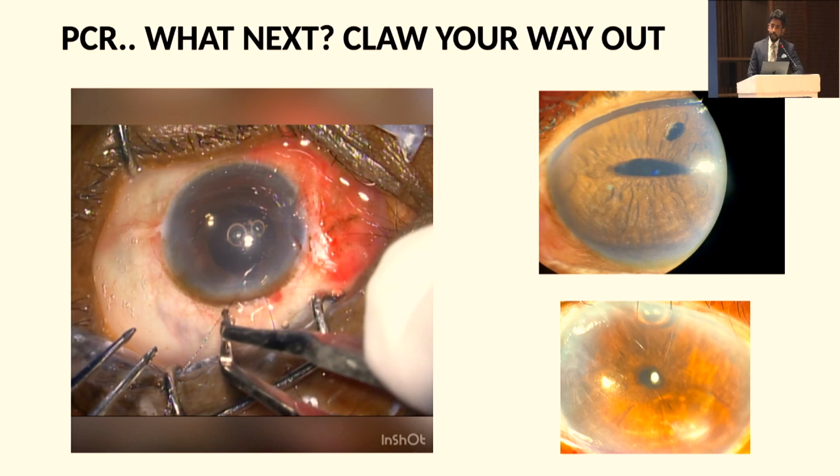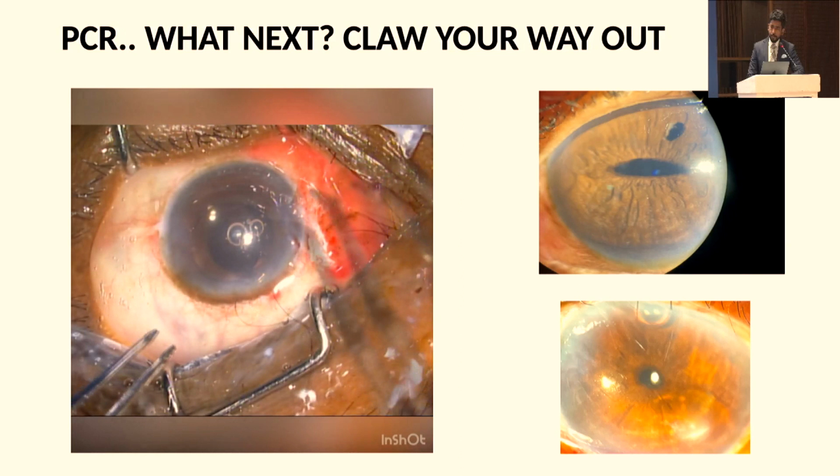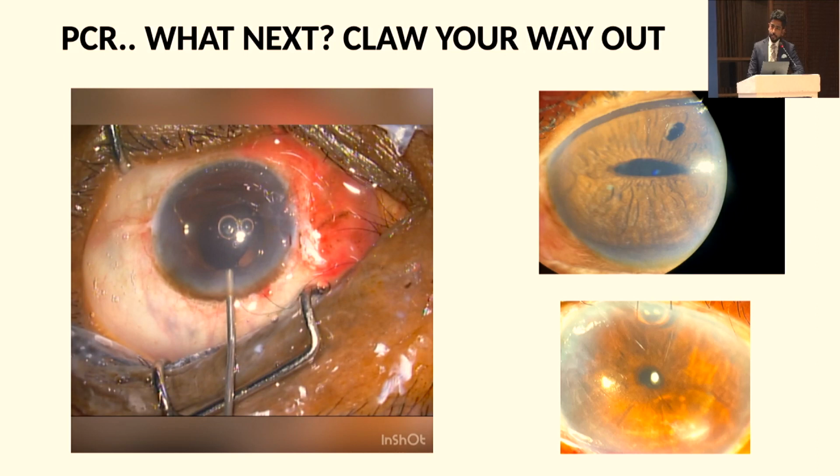And on the right side, you can see the orientation, and that there's a cat eye. Initially, a postgraduate can have a cat eye pupil. Later on, after a certain practice, he can get a well-rounded pupil.